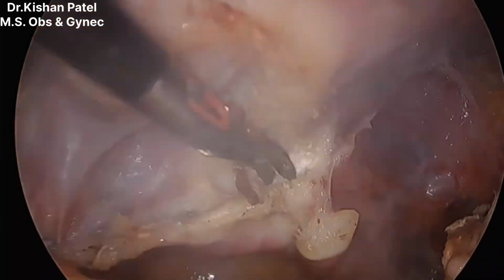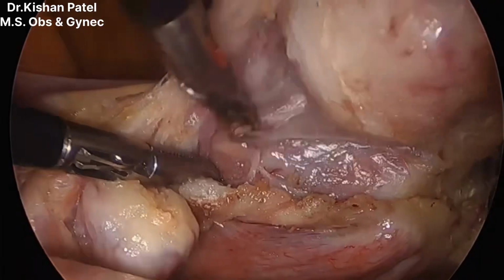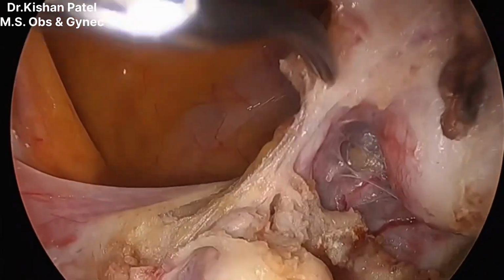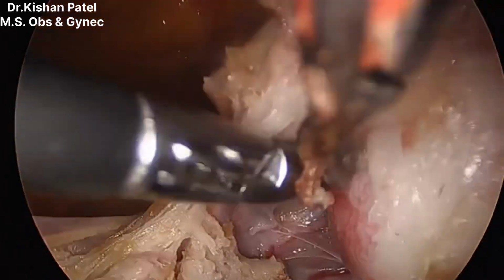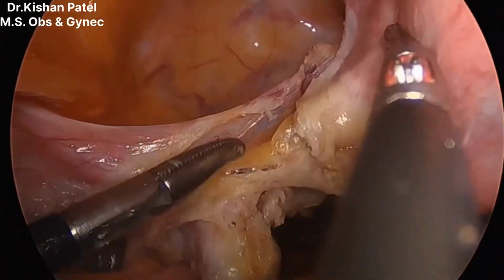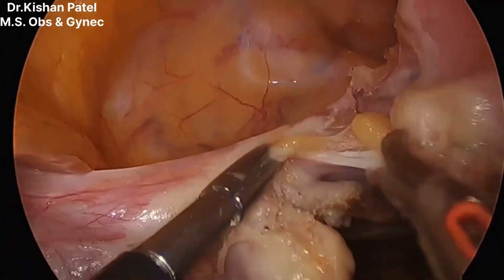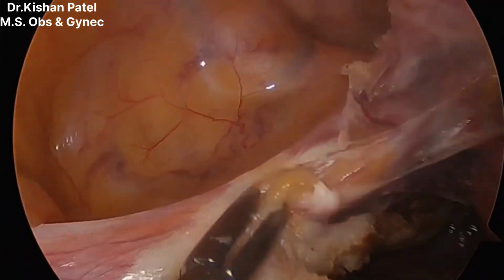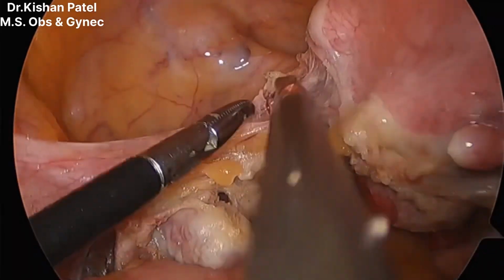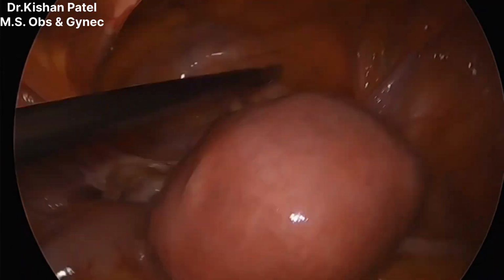We have completed separation. You can see the uterine artery from behind, very beautifully seen, right? Yes, it is there. I am skeletonizing the uterine artery. On the left side, you can see a tortuous uterine artery. Yes.